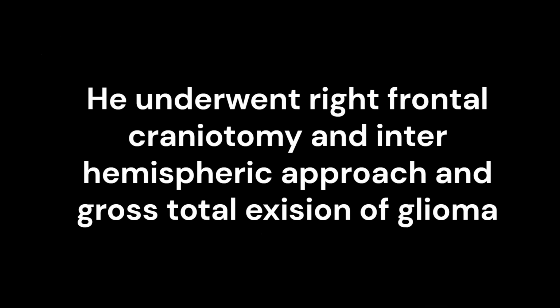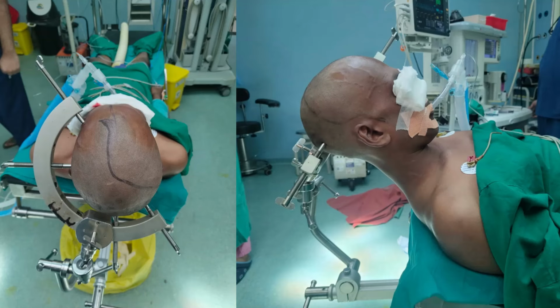With these findings, he was planned for a frontal craniotomy with interhemispheric approach and excision of the tumor. The frontal craniotomy was planned extending to the opposite side of the superior sagittal sinus, exposing completely the anterior part of the superior sagittal sinus.